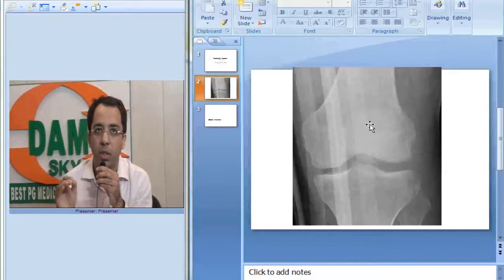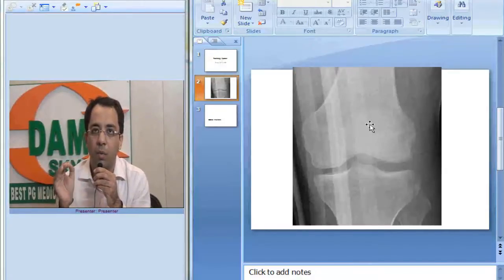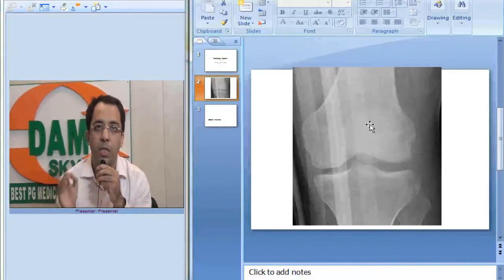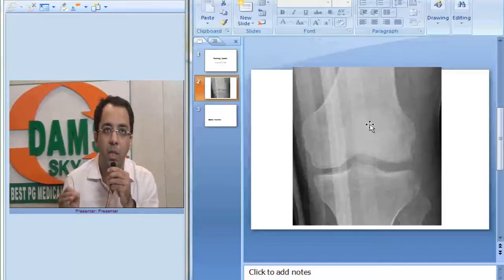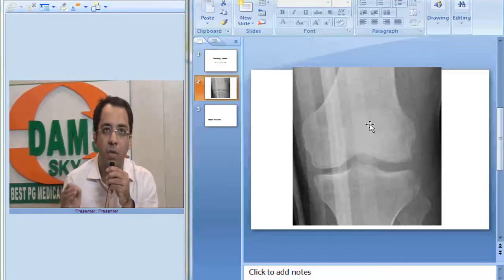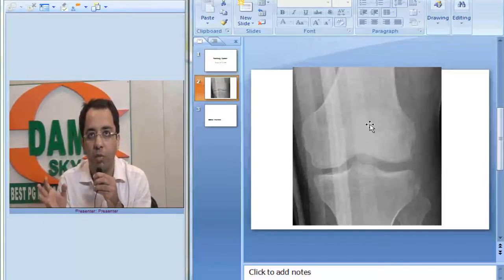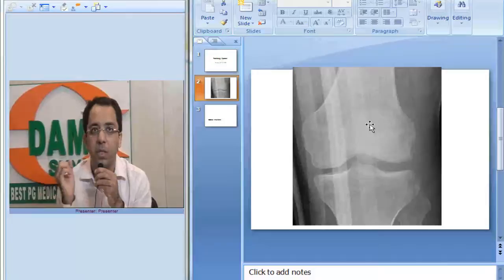is highly associated with ACL tear. Anterior cruciate ligament tear is associated in 75 to 100% of cases of a Segond fracture.